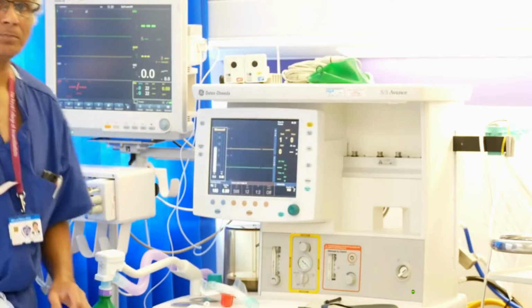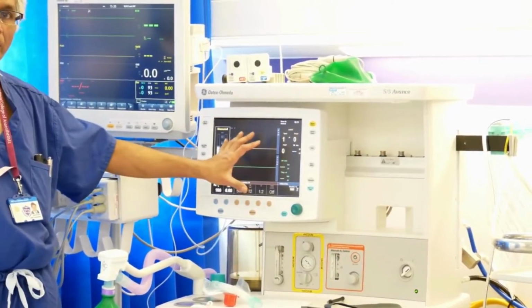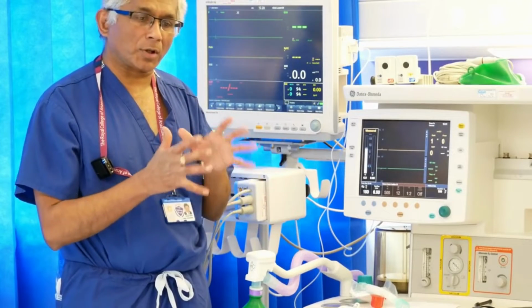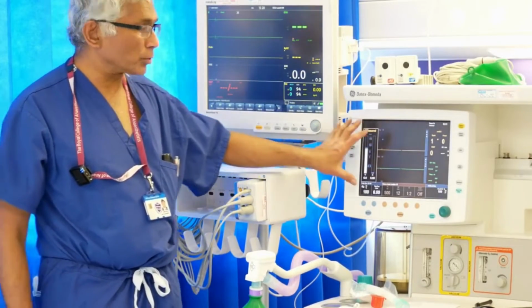Hi, I'm Lalit. I'm going to show you the ventilator screen. When you come and your patient is already on the ventilator, there are two screens here.